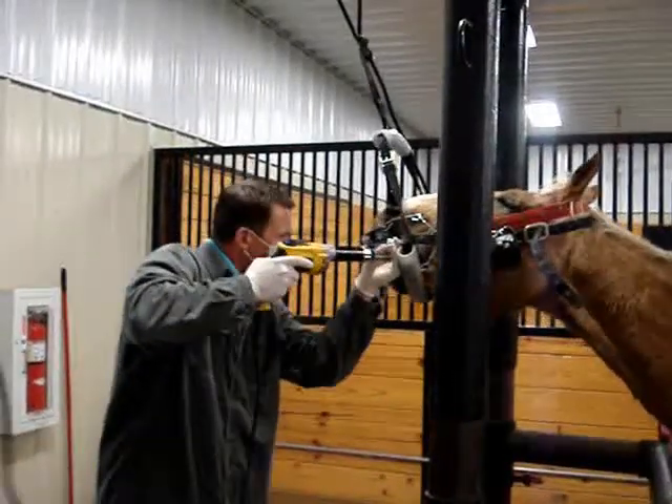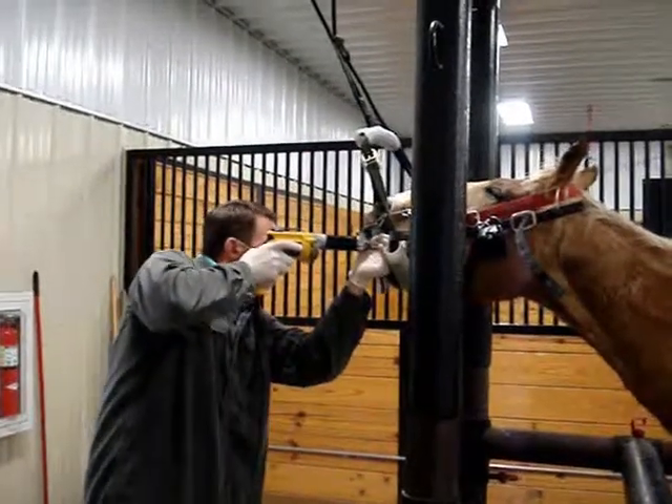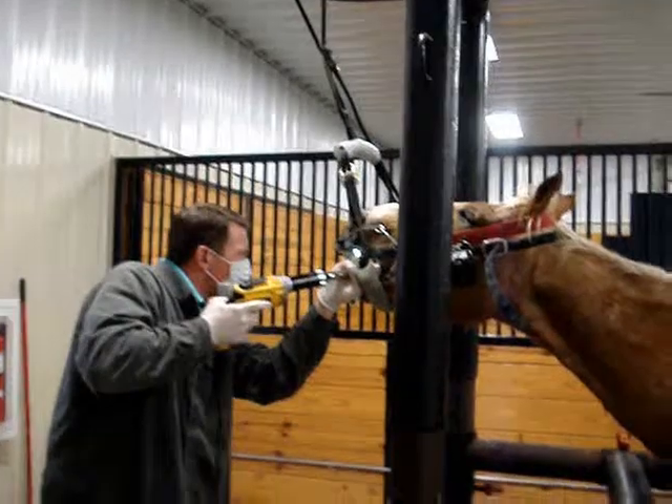We use a powered dental float, which has a rotating diamond bit on the end of a long shaft. This tool allows us to make dental corrections quickly and painlessly.